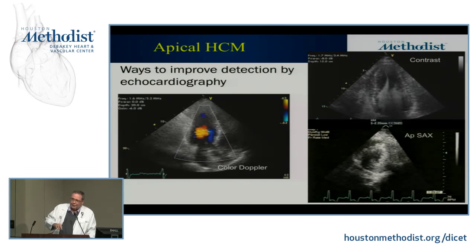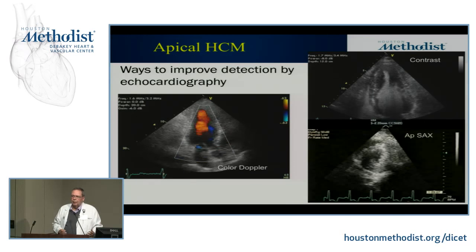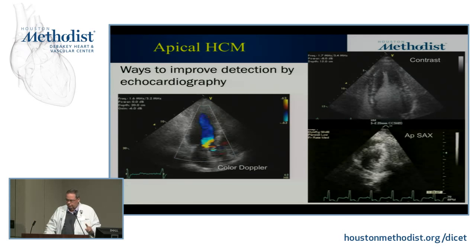But you have to suspect it so that you are willing to spend $100 popping a contrast ampule and also putting in an IV. So it's a matter of thinking of it. Otherwise, a patient may go through the lab and it be totally missed. And we have missed them in the past. So the sonographers, you are the first line of thinking through it and being suspicious of it.